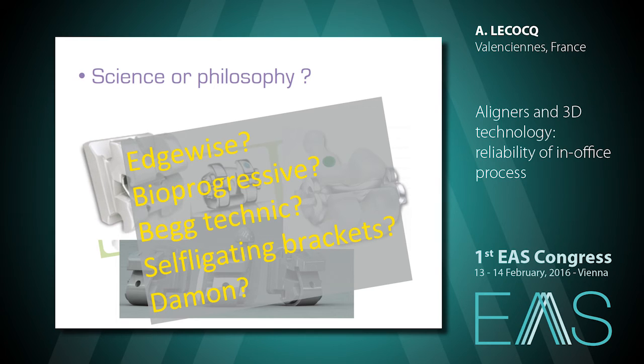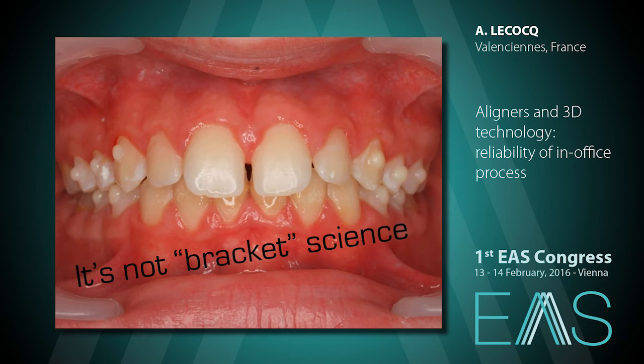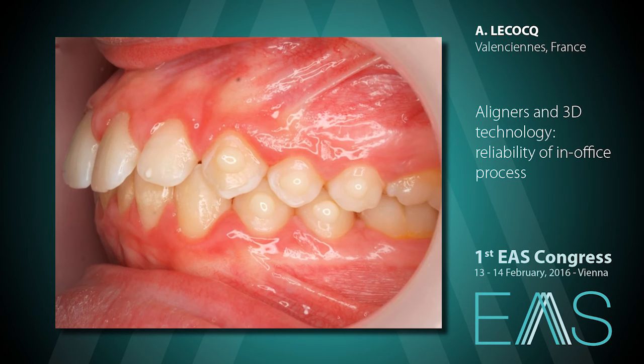And as far as the goal of the attachment is to increase the contact between the teeth and the aligner, any kind of attachment shape that will allow to increase this contact will make an efficient attachment. That's why, for this case, I used only a simple drop of fluid resin, and that was enough to enhance the pressure on the teeth. And look at the result.